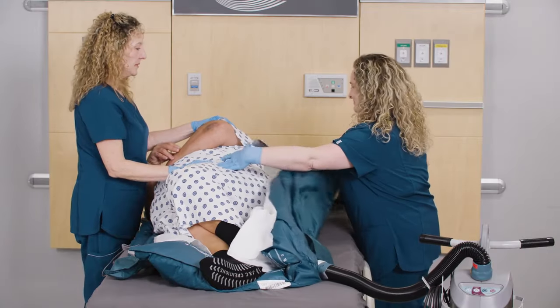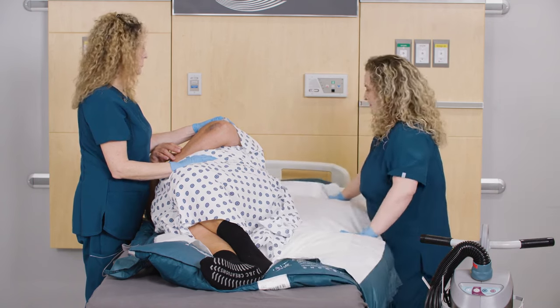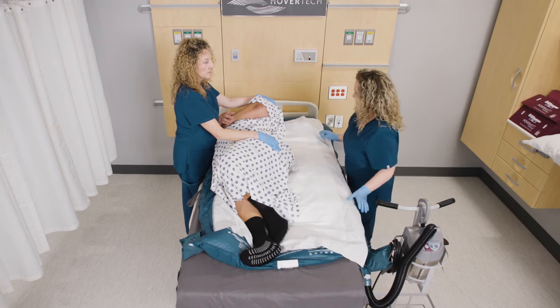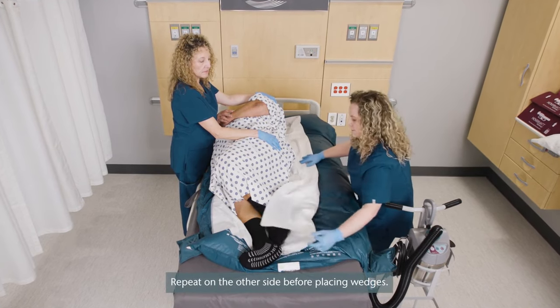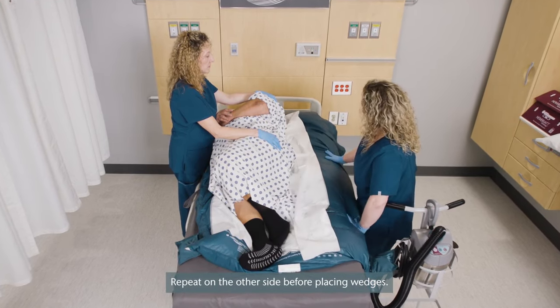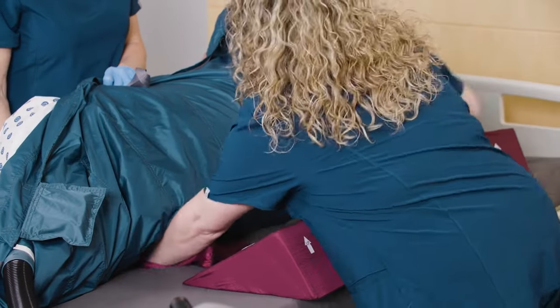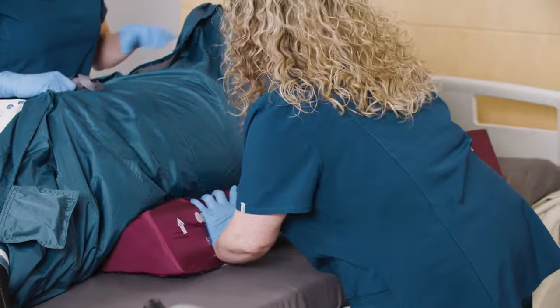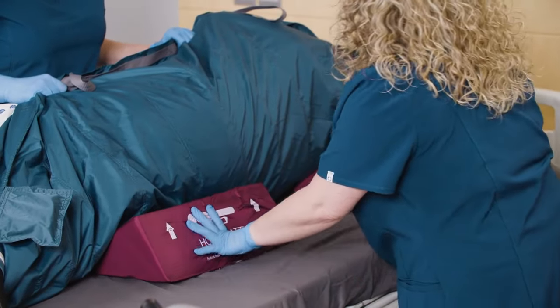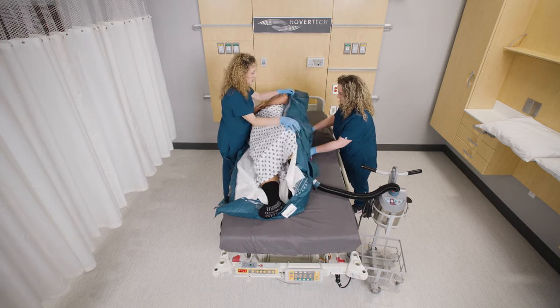If replacing the hover cover or performing a hygiene turn, the opposite caregiver will brace the patient on their side, while the turning caregiver releases the handles and holds the patient's hip and shoulder to stabilize. While the patient is turned, hygiene can be performed and the hover cover removed and replaced. Locate the sacrum. Insert the tail of the wedge just under the patient's thighs. Place the standard wedge to support the patient's back about one hand's width away from the tailed wedge. Lower the patient onto the wedges.